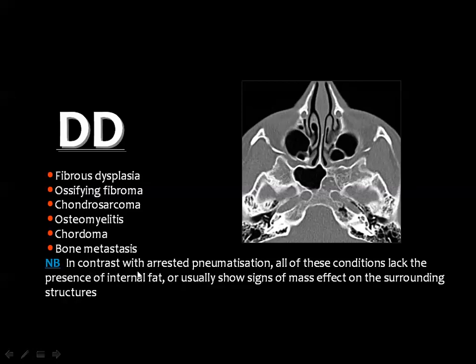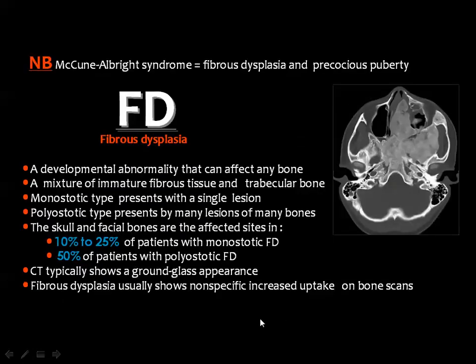Then, in contrast to arrested pneumatization, all these conditions lack the presence of internal fat within the lesion and usually show signs of mass effect on the adjacent structures.